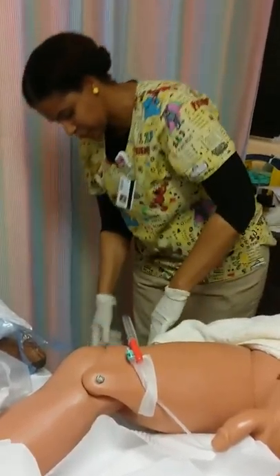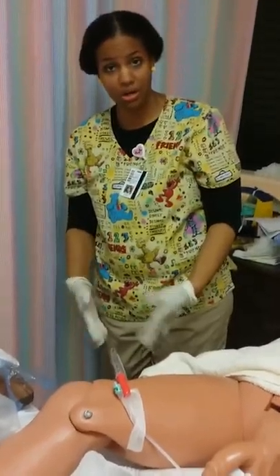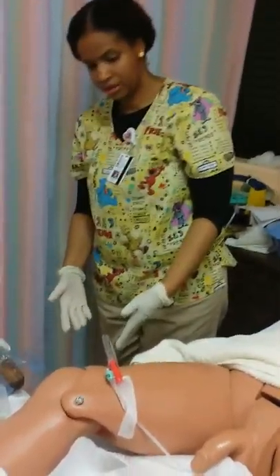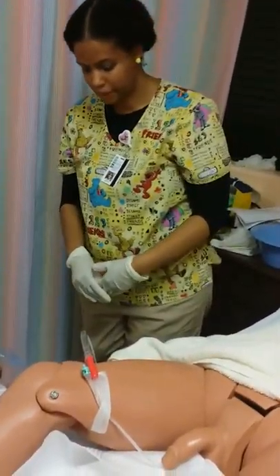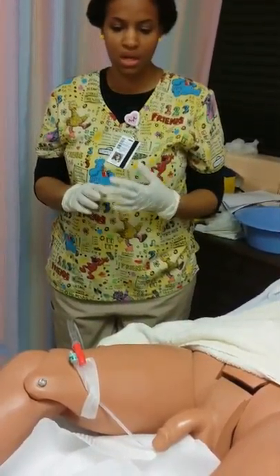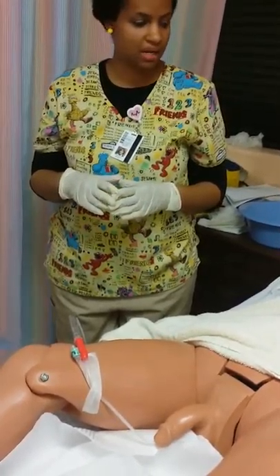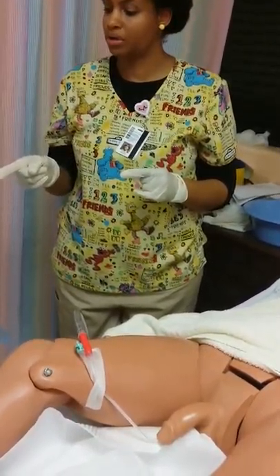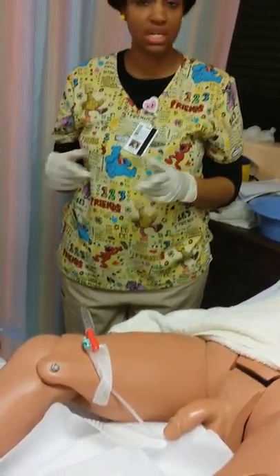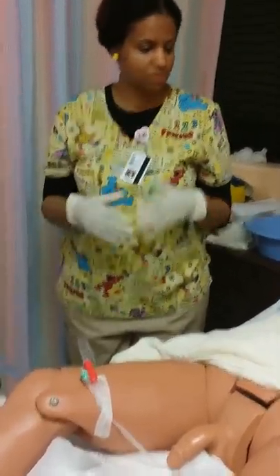And then checking to make sure as the urine flows out, I'm watching the color. I'm checking for the color, the flow of the urine, and how much urine there is. And I'll be sure to document all of this. I will document the color, how much urine there is, and sign and date my name. And also, I want to put how much sterile saline I put into the balloon, as a courtesy to the nurses and to my patients.